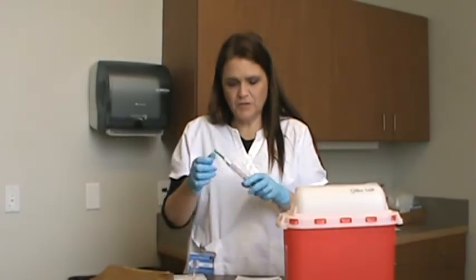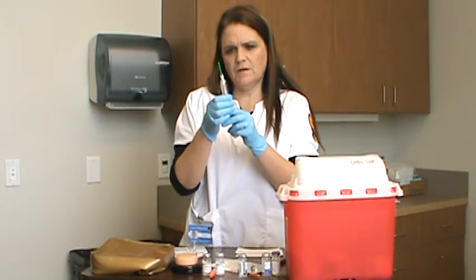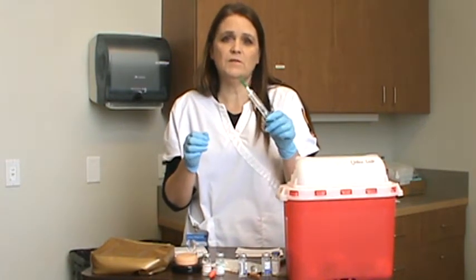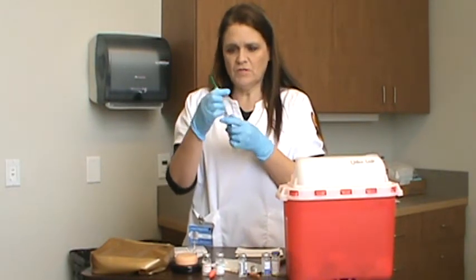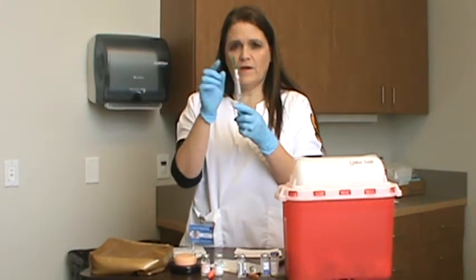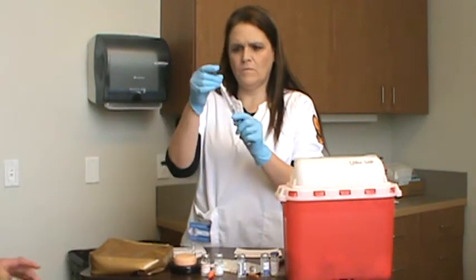Like I said, here's the Carpuject. This one has 2 mils in here, and because this is a high-risk drug, I will need to waste some because she is getting 1.5. Make sure there are no bubbles in there, and there aren't. So I have to show in front of the nurse that I am wasting this.